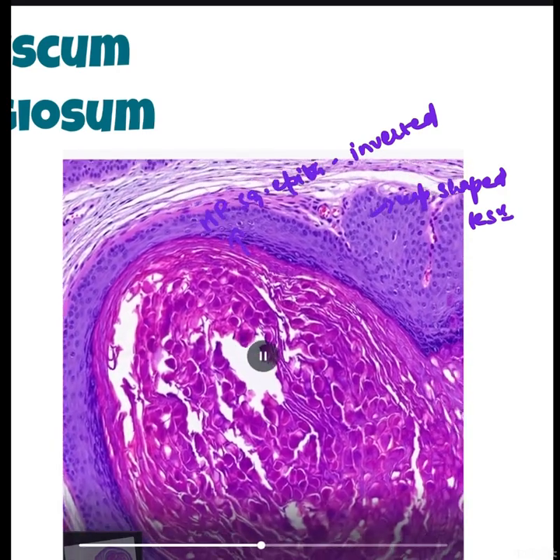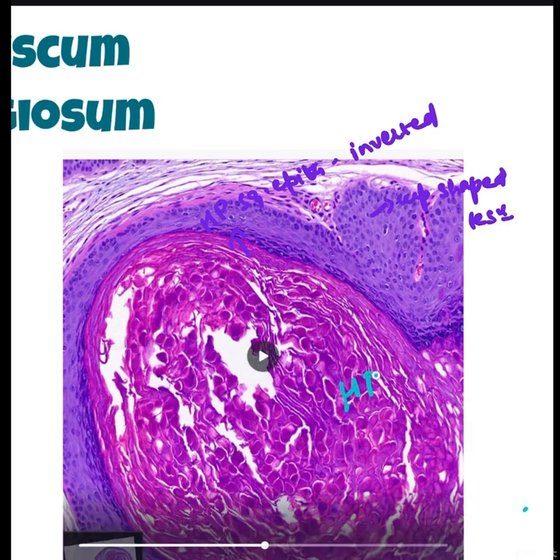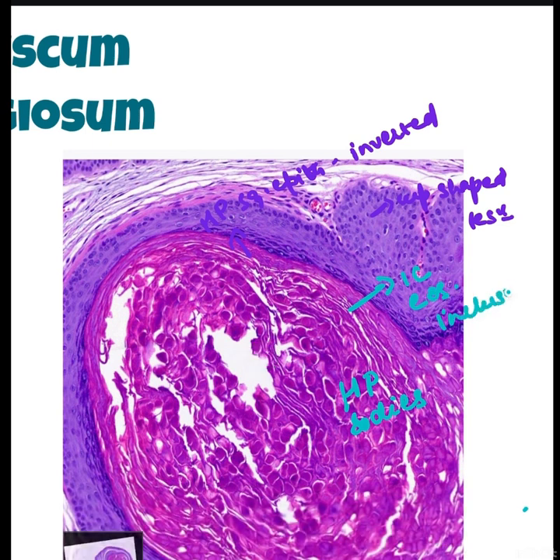So these are the Henderson-Patterson bodies. These are nothing but intracytoplasmic eosinophilic inclusions due to molluscum contagiosum. Very, very characteristic.